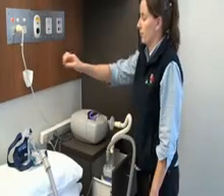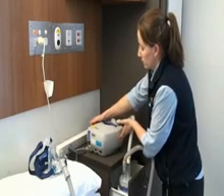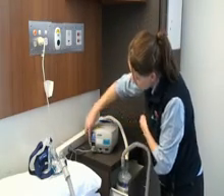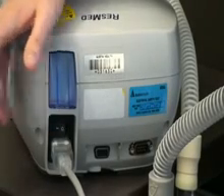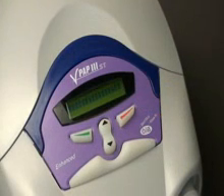Preparing for use before bedtime. Switch on at the power point and make sure the power switch at the back of the machine is turned on. The display screen will light up. The ventilator is now on standby, ready for use.